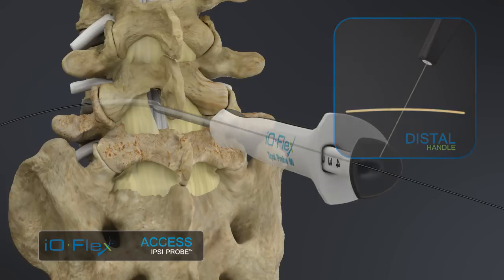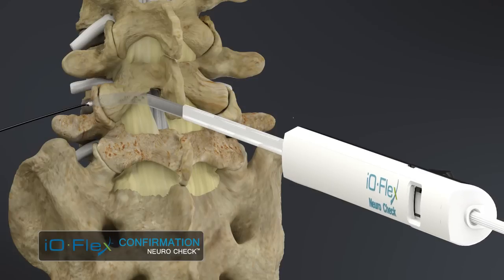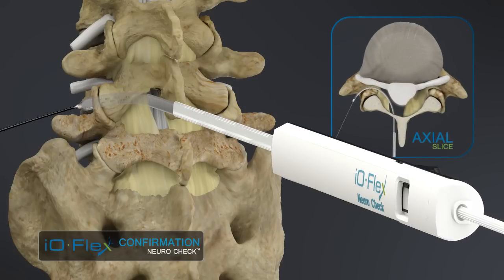The probe is then removed. The neurocheck device is then attached to the guide wire and pulled into the foramen. EMG stimulation is used to activate the electrodes, confirming that the guide wire is positioned dorsal to the nerve root.